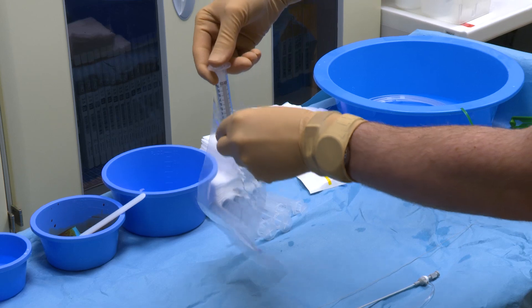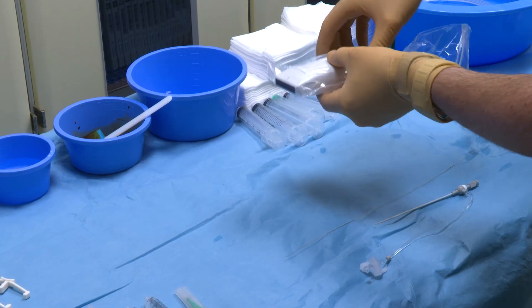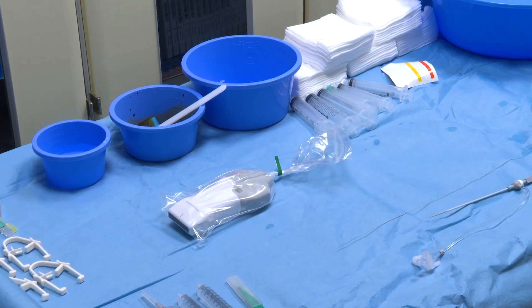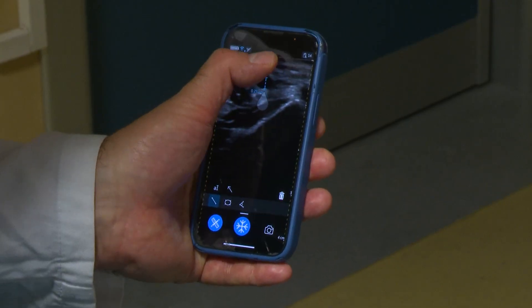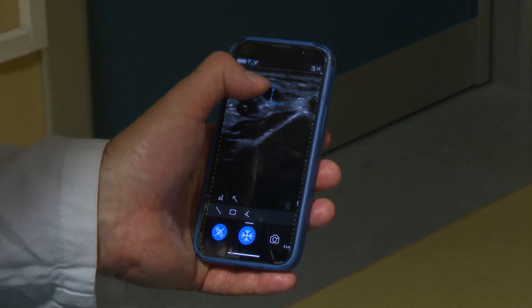When puncturing an artery in the cath lab, it's really important to maintain sterility. We use a drop of saline within the backing and it's very effective in transmitting the ultrasound and avoiding transmission issues. The app actually allows you to measure the diameter of each arterial site we are exploring, just to select the most appropriate one for the procedure we are going to perform.